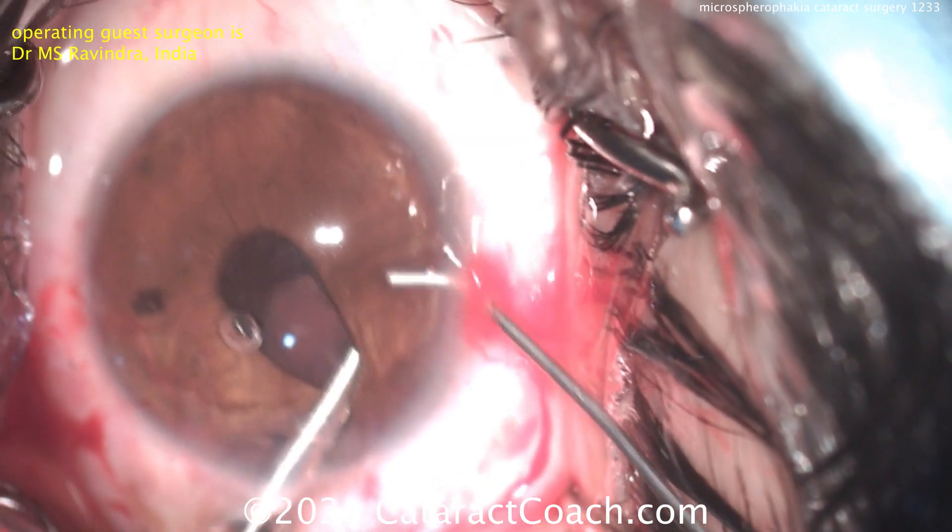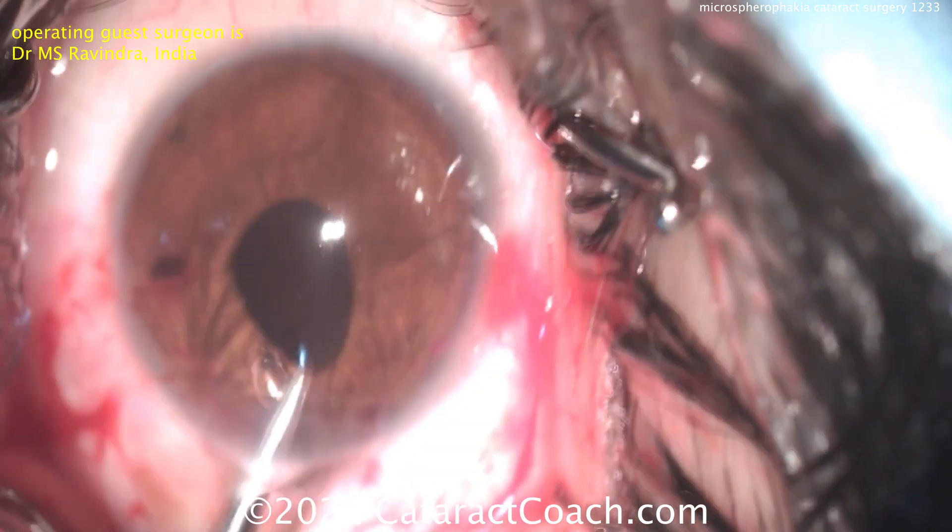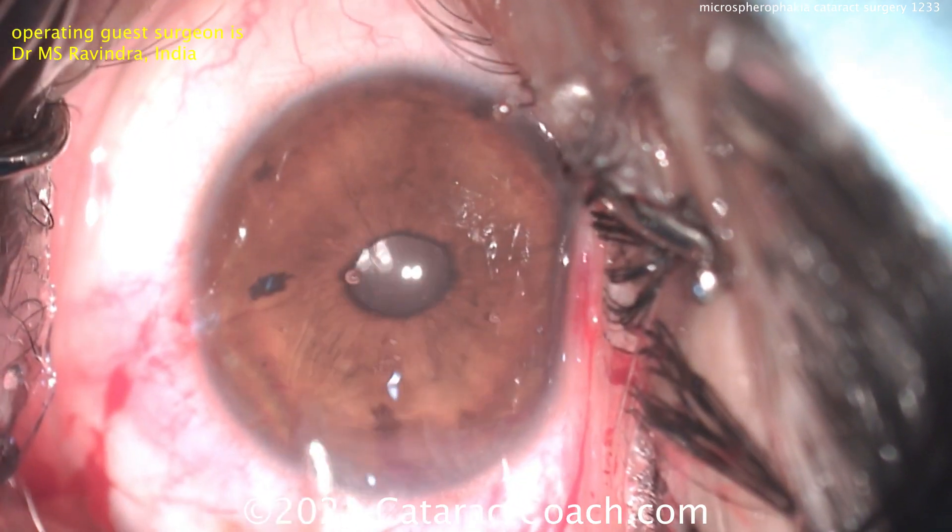In this case, you also have a nice small peripheral iridotomy, which will be helpful. The peripheral iridotomy is going to be of good help. And there's the end of the case.